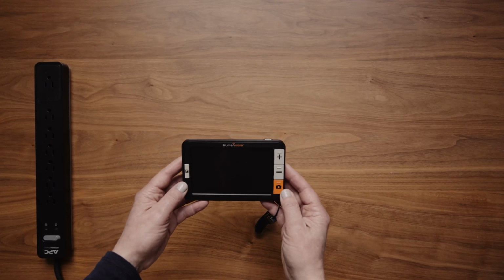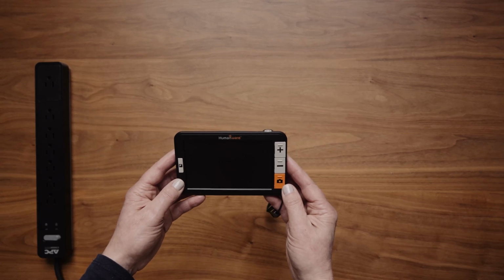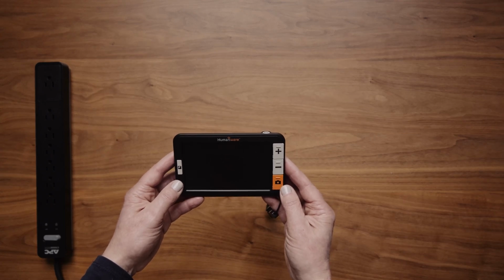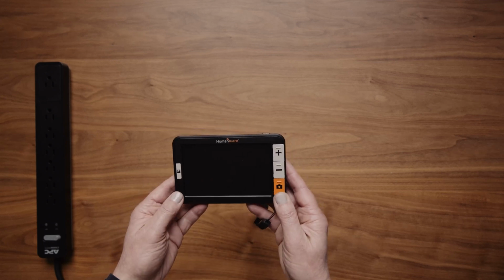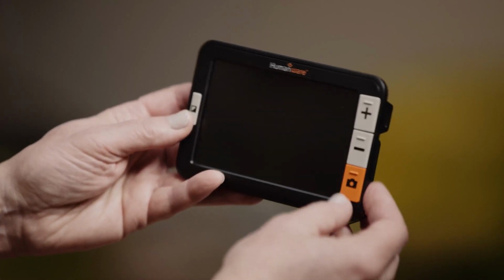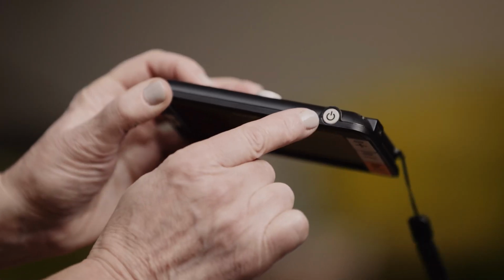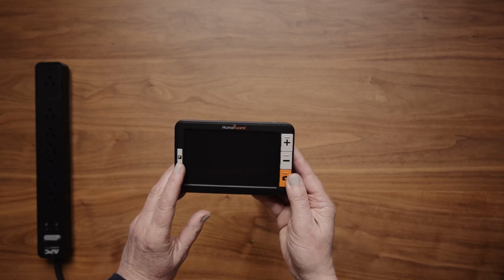Layout and orientation. Hold the Explore 5 with the screen facing you. There will be one button on the front left of the screen and 3 tactile buttons on the right. On the top right edge of the Explore 5 is the power button. The left button on the front face is the contrast button.